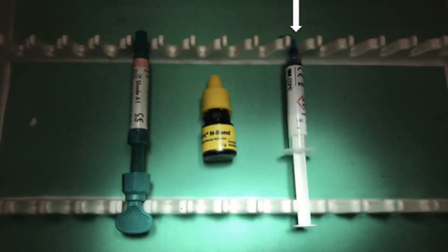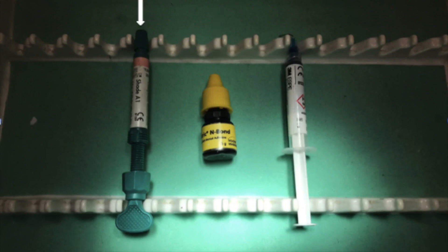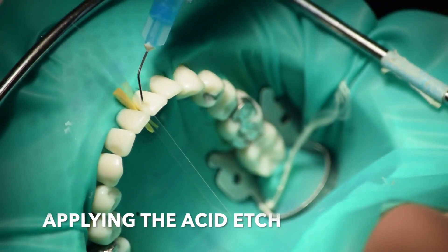For applying composite, you'll need an acid etch, an adhesive, and the composite shade you've selected earlier. First, apply the acid etch.